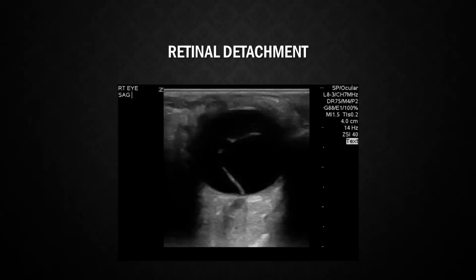In addition, you can actually miss smaller ones if you don't scan through both planes fully. So make sure you're fully scanning through in both planes and utilize the extraocular movements, because that might actually be the difference between you missing or finding a subtle retinal detachment.